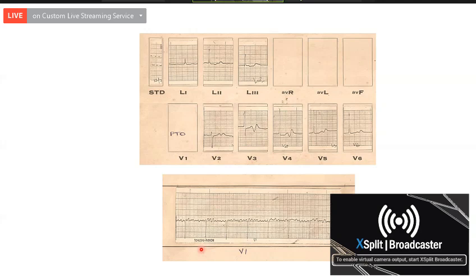What else? What may be the reason for this patient? Do you think that this can be digitalis toxicity? Yes, sir. Because this patient is having atrial fibrillation, the patient might have been put on digitalis, and the patient might have gone in for digitalis toxicity.